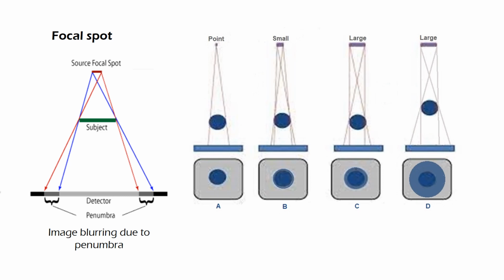A large focal spot, which permits higher X-ray output intensity with shorter exposure time, should be used in situations where motion is expected to be a problem and geometric magnification is small, that is, the object is close to the image receptor. On the other hand, for magnification studies, a small focal spot is necessary to limit geometric blurring and achieve adequate spatial resolution.